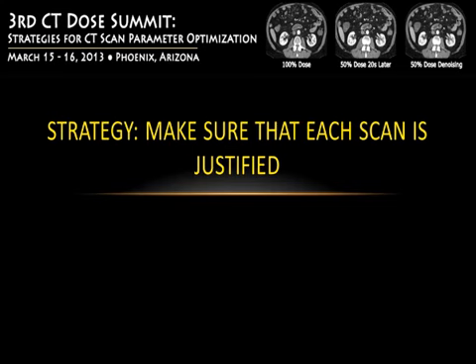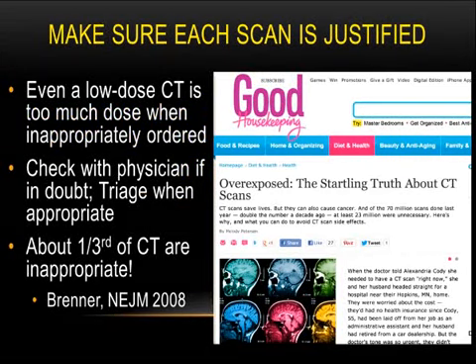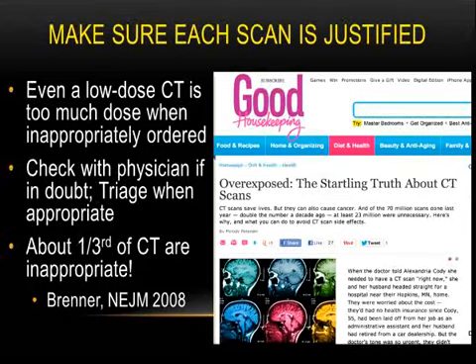Strategy number one, make sure that each scan is justified. And I know it is sort of commonsensical. Even the lowest dose scan is wasted dose if it is not performed appropriately. And the onus of this, at least in a tertiary care hospital, falls on the fellows and the residents who protocol these studies. So they'll read the indication and they'll go through next day's list and call up physicians if they think an exam is inappropriate. And there have been some data saying as much as 1/3 of CT scans are unnecessary.